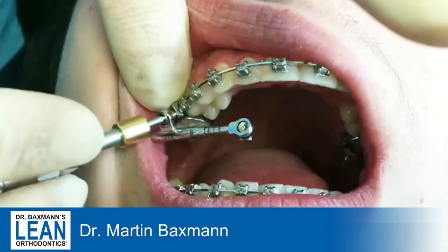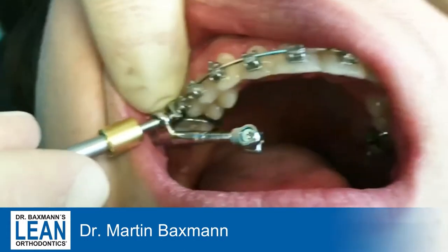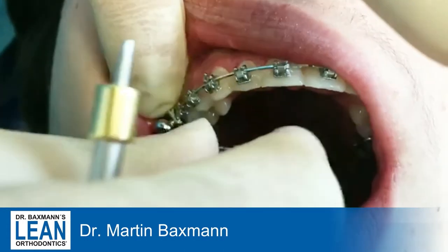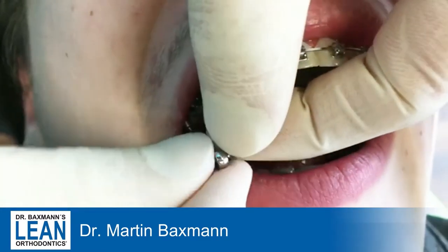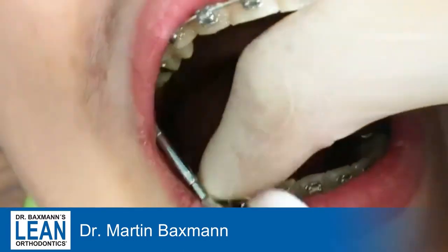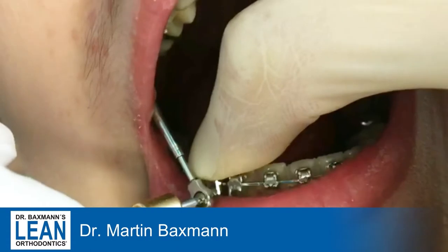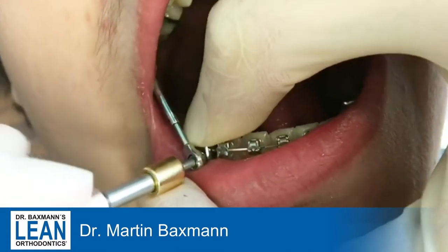When I use a Class 2 appliance, it should be one that is easy to insert and easy to remove as well, like the Power Scope by American Orthodontics. You fit it first in the upper arch by sliding that bracket-type part of it onto the wire and then securing it with a screw, which you can easily tighten with a screwdriver that is included in the Power Scope package.